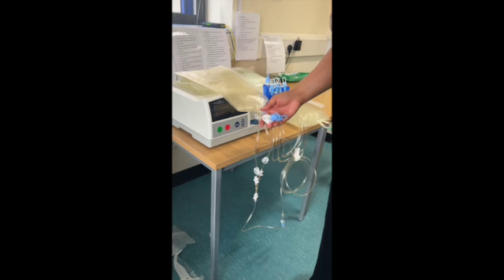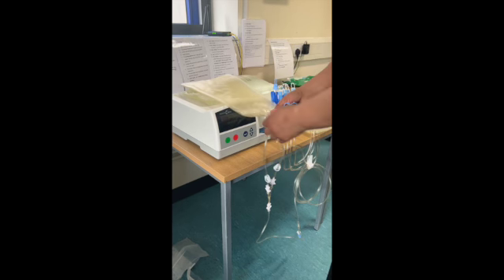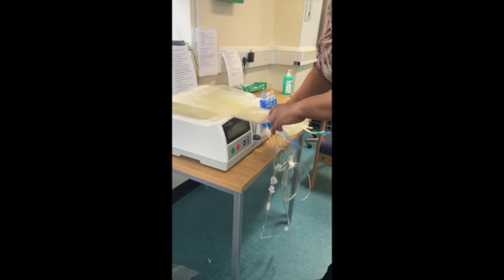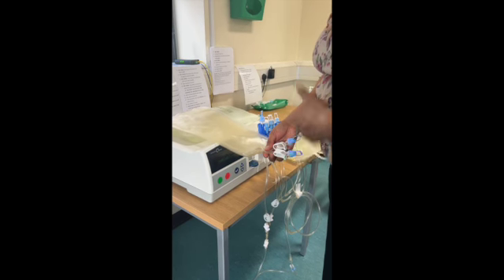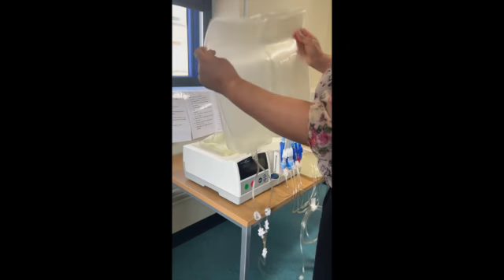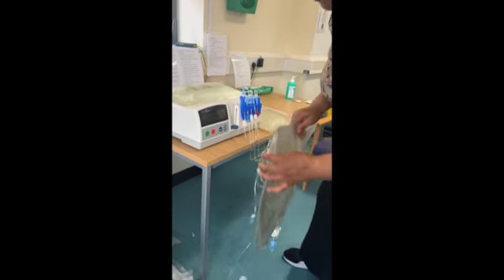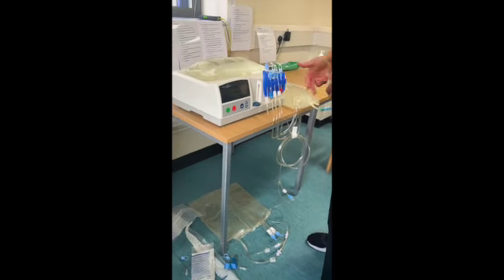I'm now going to close the large clamps on the drainage bags and leave the small clamps open. It is important that you close these large clamps, because if you don't, you'll wake up to a big mess in the morning. So I'm going to open the drain bags and put them on the floor. Now, make sure that the shiny side is facing upwards, or sunny side up, as I would like to say. It might also be helpful to buy a plastic crate to put this into, just as a double protection.